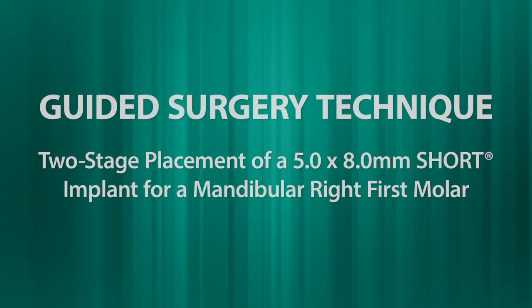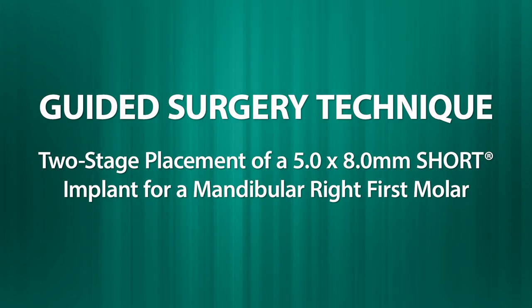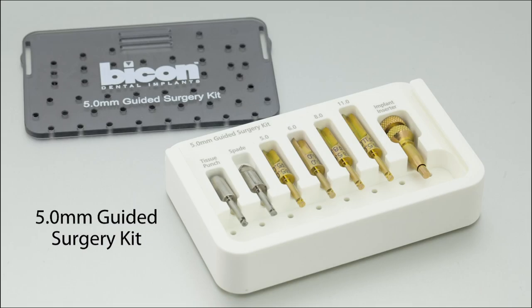It should be noted that Bicon's guided surgery kits are specific to the diameter of the intended implant, and unlike regular reamers, which subsequently widen an osteotomy, guided reamers subsequently deepen an osteotomy. This video will demonstrate the two-stage placement of a short implant utilizing Bicon's guided surgery kit.